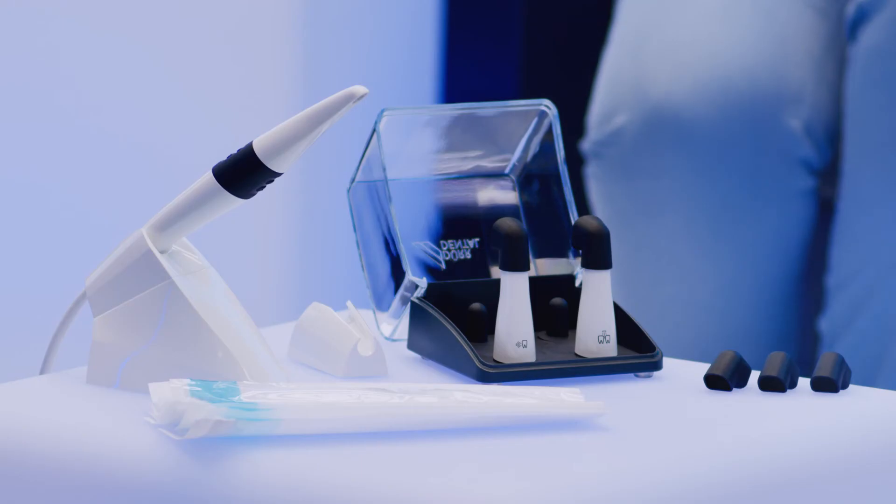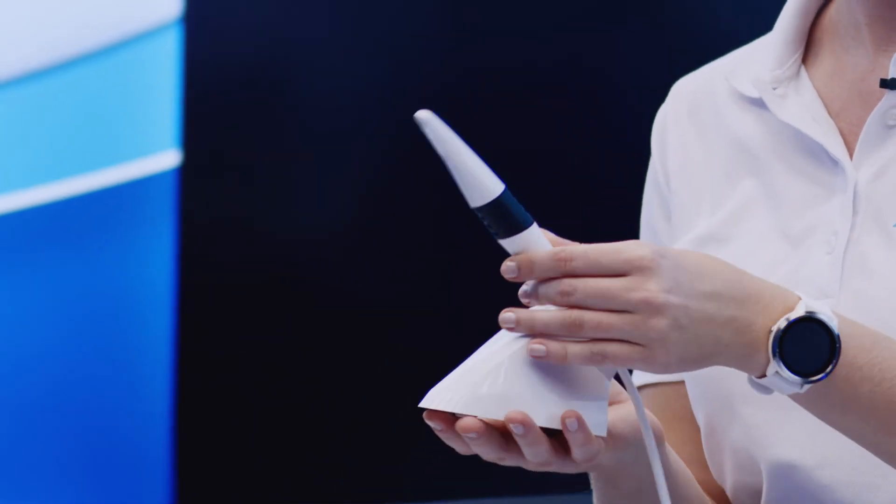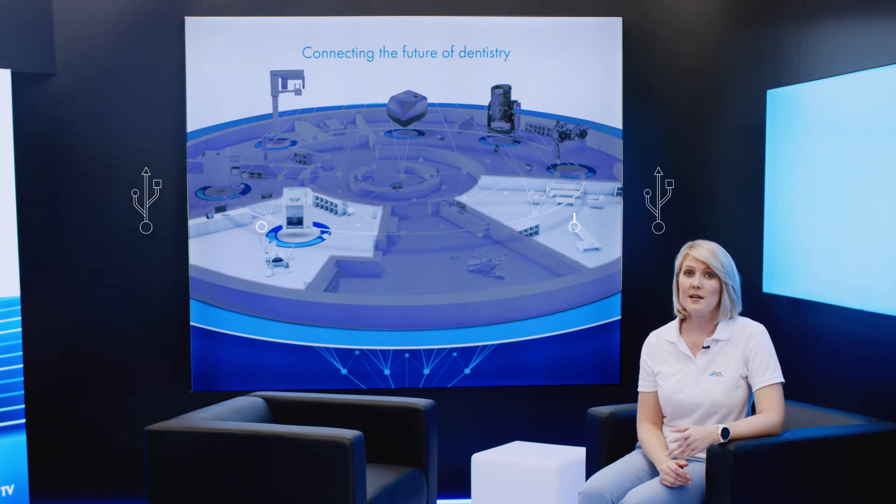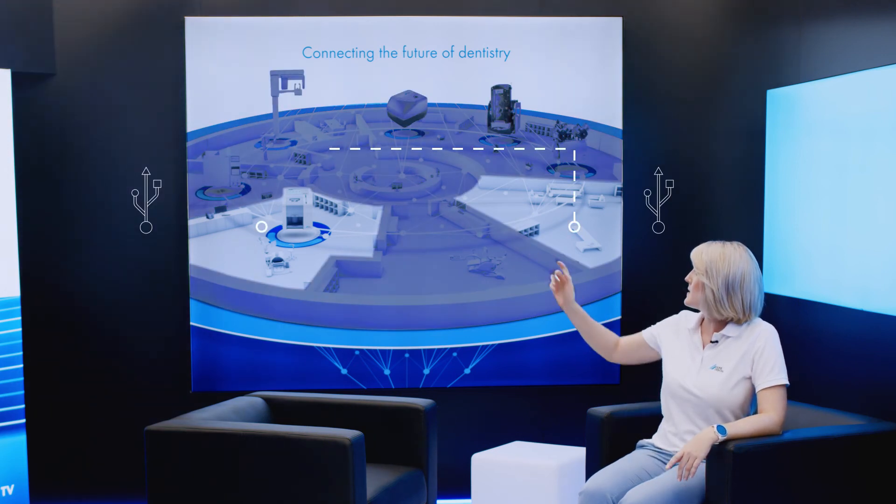The Vistacam iX-HD Smart is available in various camera packages depending on which interchangeable heads you want to use. Besides the camera itself, the scope of delivery includes a handpiece holder, hygienic protective covers and spacers. An active handpiece holder is also available as an optional accessory, which you can use to extend the cable if required. The Vistacam iX-HD Smart connects via USB, meaning you can take the camera with you from one treatment room to the next really easily. The Vistacam iX-HD Smart can also be controlled from a Windows tablet, making the system even more portable for your practice.